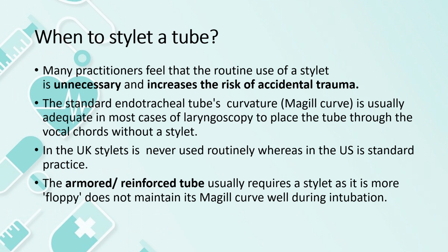There is a debate on when to use the stylet. Some centers say it should be used routinely, and other centers do not use it as a routine practice because of the fear of the accidental trauma it might cause. But in some cases, like in armored or reinforced tubes, a stylet is recommended because these kinds of tubes are floppy and cannot be easily navigated to their destination.